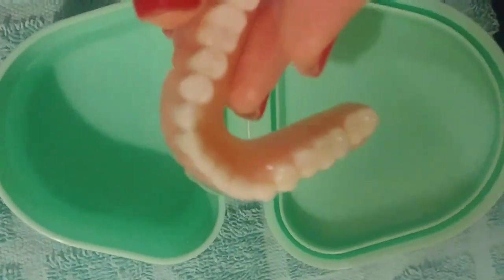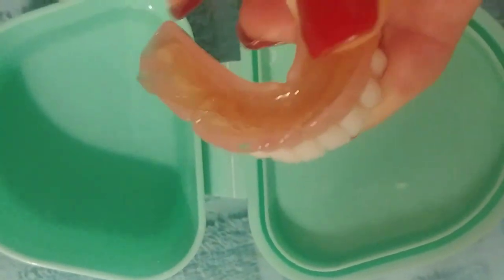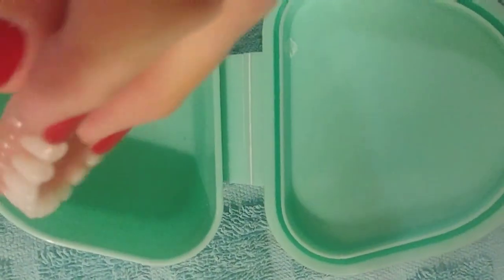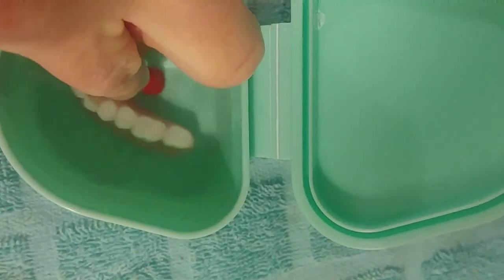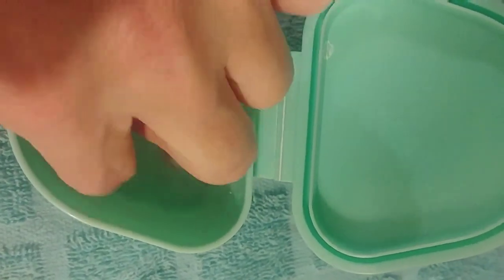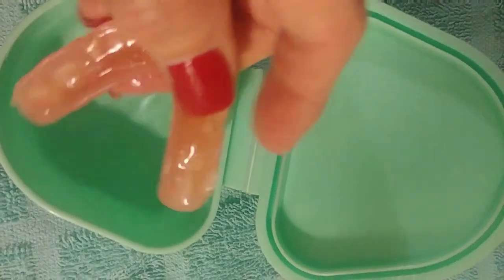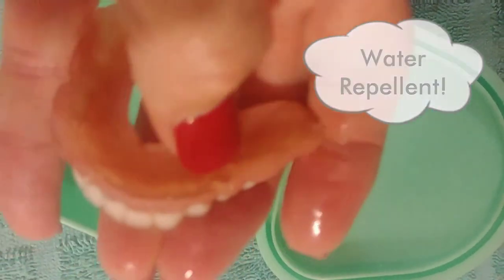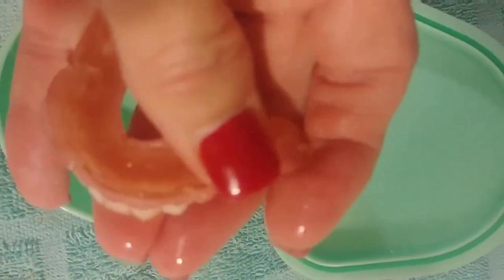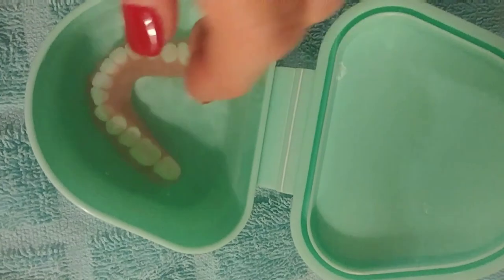I was going to show you how comfort lining acts as a waterproof barrier and a cushion. I have stuck my bottom lower denture into my denture bath with the comfort lining on it. Comfort lining is still on my denture as tight as it was when I put it on there — it will not come off.